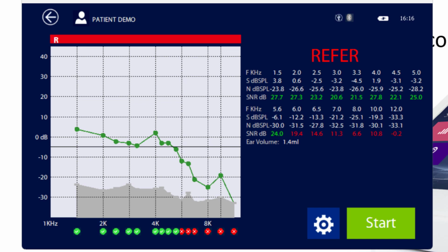In real life, of course, patients can also make noise, but if it's just heavy breathing, then it's very easy to overcome, and we find the silent moments and have a very good measurement. If it is crying, then it's probably so loud and so constant that the measurement might be more difficult to complete. But let's see.